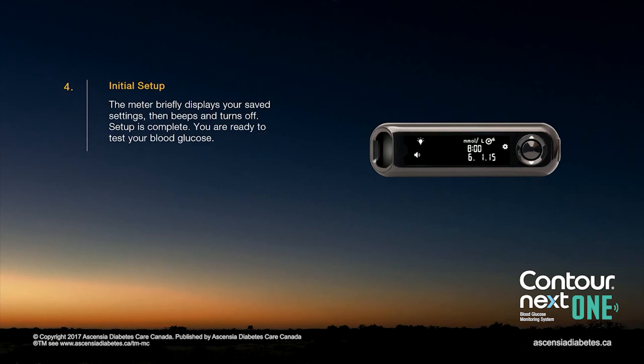The meter briefly displays your saved settings, then beeps and turns off. Setup is complete. You are ready to test your blood glucose.